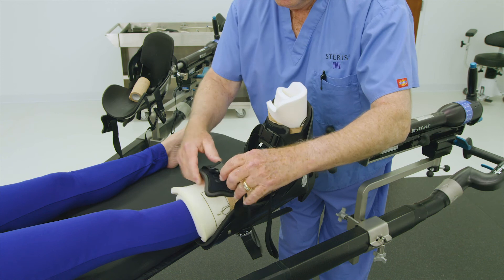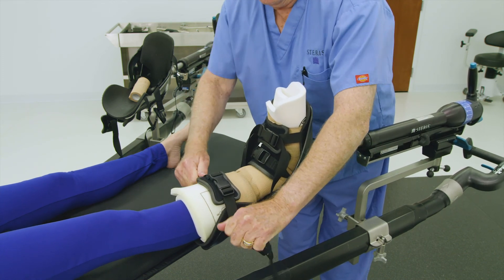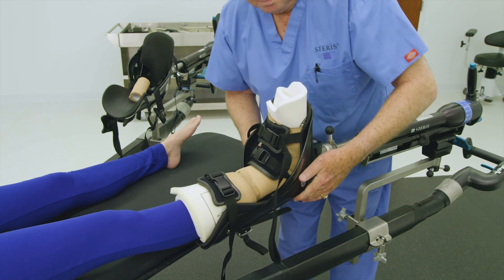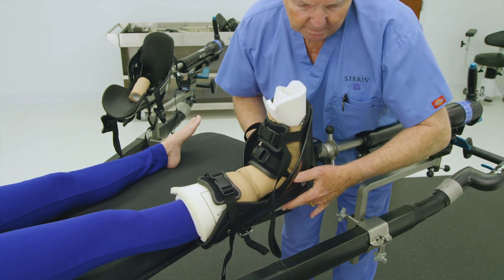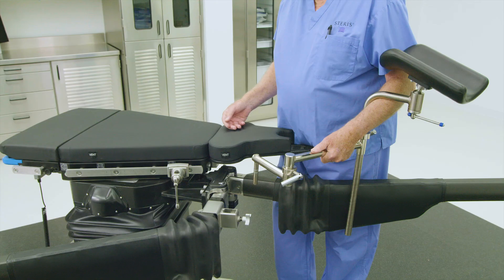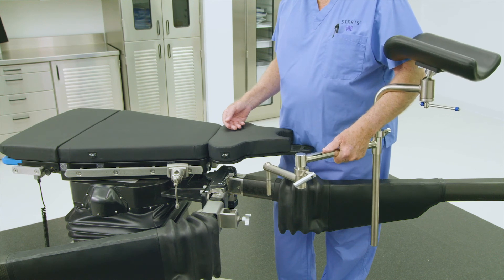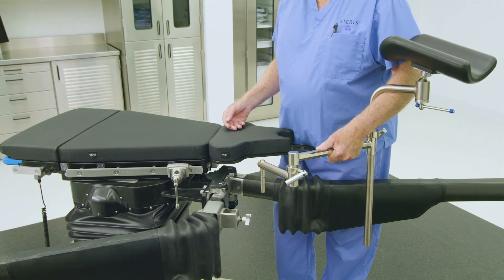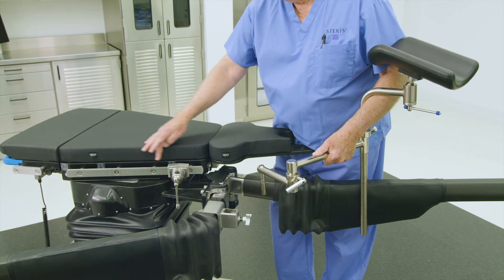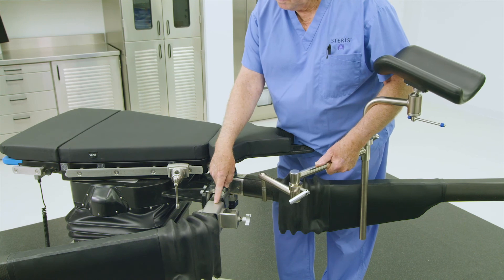Repeat these steps with the other patient's foot as clinically necessary. Some orthopedic procedures may only require one patient's foot in leg traction. A universal leg holder will be used for the other leg in these unilateral situations. Most unilateral orthopedic cases will employ the use of a universal leg holder to position the non-operative leg during the surgery. A socket clamp for the side rail or a spar clamp can be used for accurate positioning.